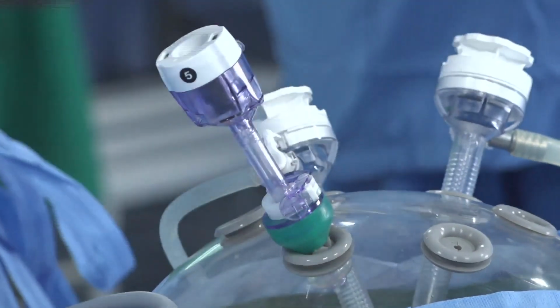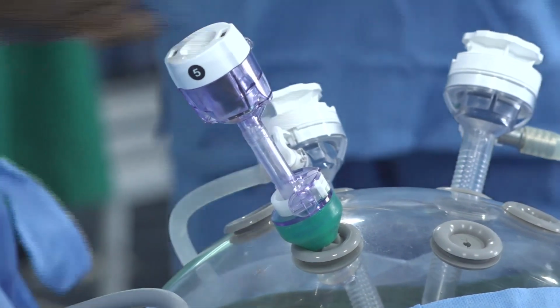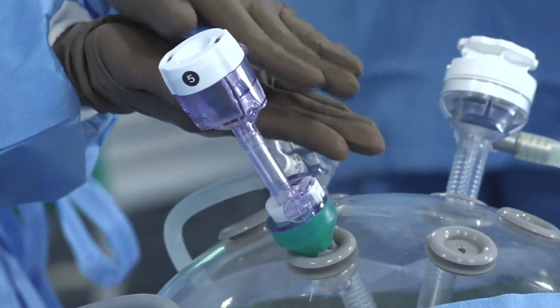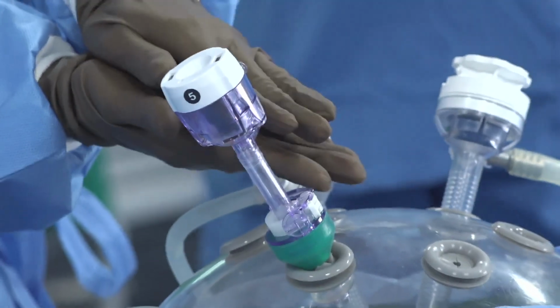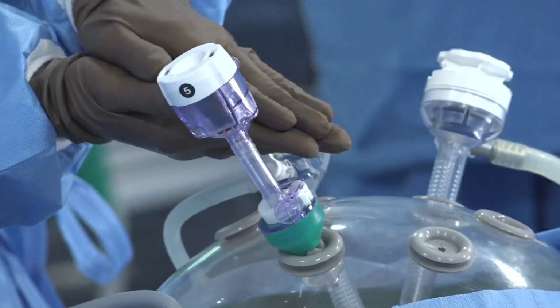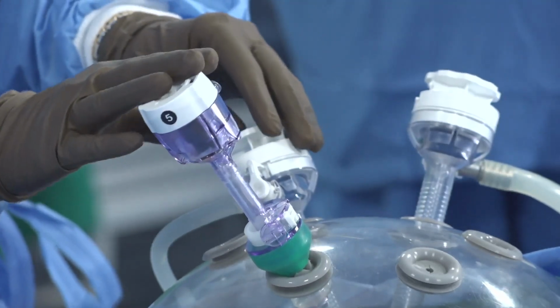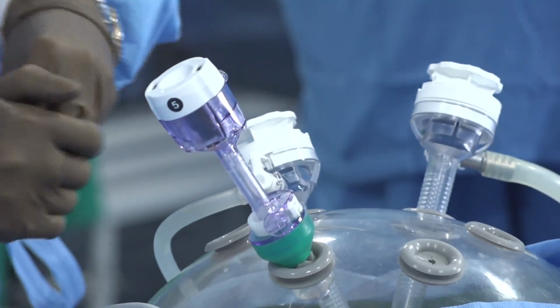So the port is actually sandwiched between, like that. It is sandwiched between the two balloons. So there is absolutely no chance of trocar dislocation and any aerosol leak. That is why balloon trocars are very important in a PIPAC procedure.